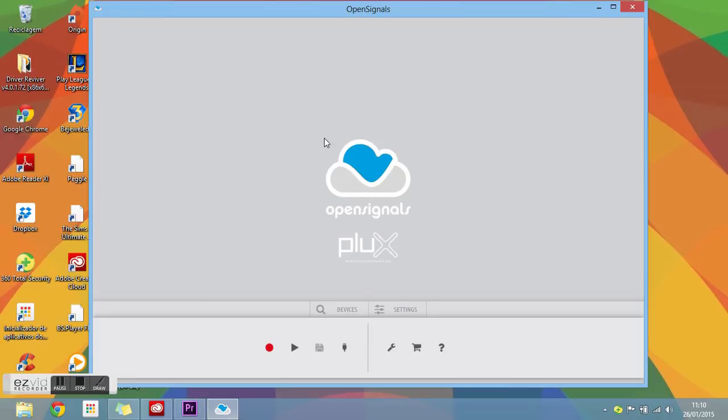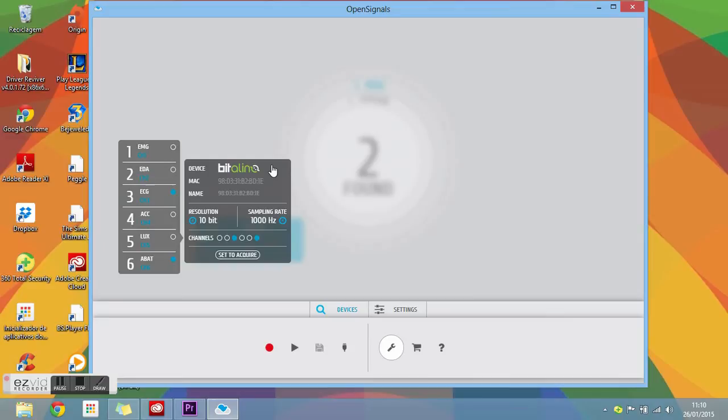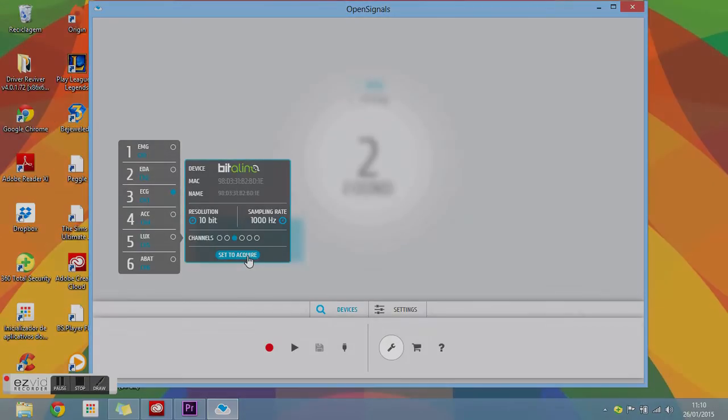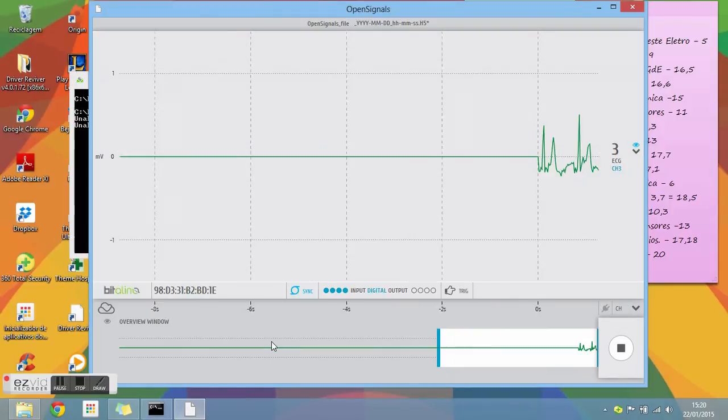Click the wrench icon and then on Devices. The program will start looking for your Bitalino. When it appears on your screen, click it, select the ECG option, and then select the Set to Acquire button. To start the acquisition, just press the red dot and you are ready to start.